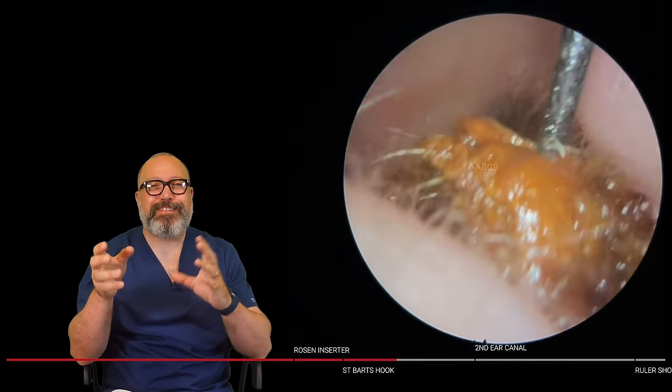Let's give this a little bit of a wiggle. Is this going to come away, or are we going to have to use some curettage on this? That's definitely on its way. You can see it's just got to the outer part of the ear canal there. Just trying to pull one of the sides through. Let's try again. Oh, nearly, nearly, nearly. There we go. Bit more of a wiggle. That's on its way now. Is it attached to the piece behind? No. So that's a nice big chunk gone there.